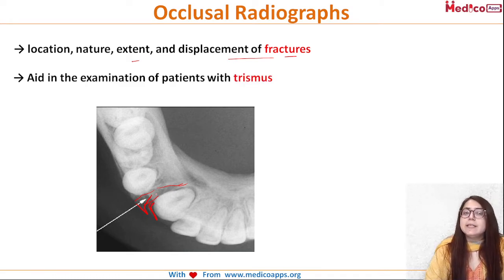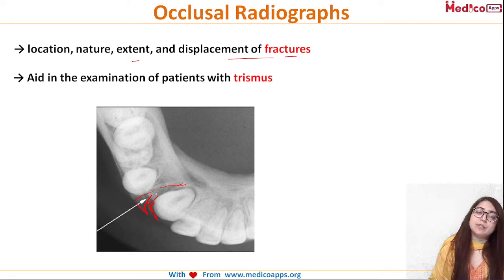Then it aids in the examination of patients with trismus. If the patient cannot open their mouth wide, suppose they are just opening 10 to 15 mm of their mouth like this, at that time you can advise the patient these occlusal radiographs.